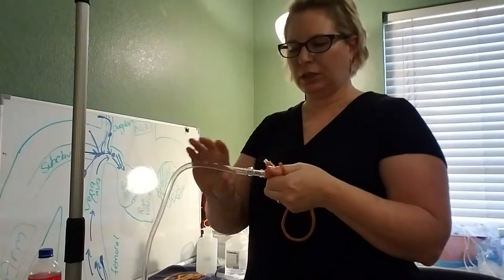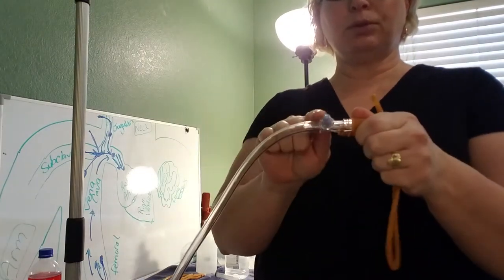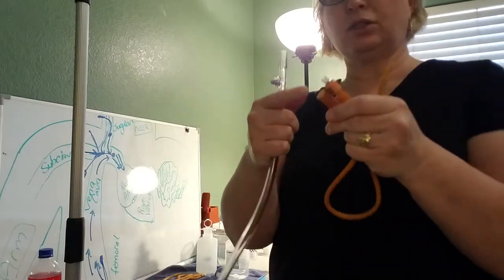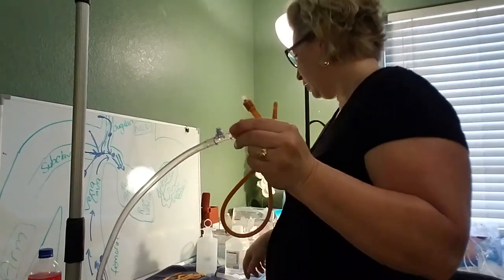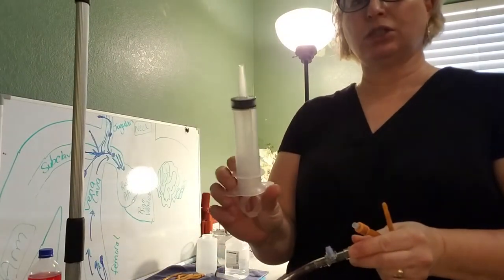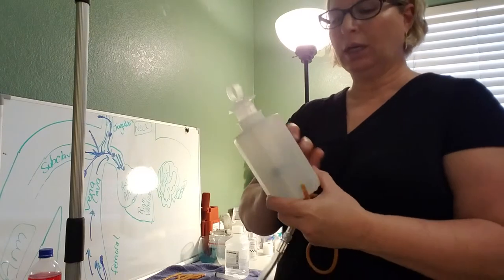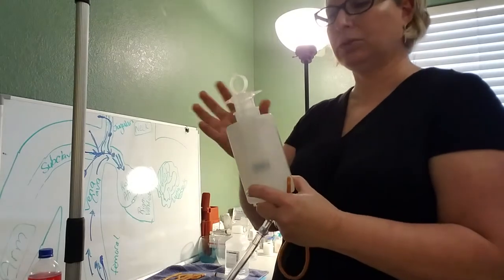If you ever needed to irrigate a Foley or do a collection sample, you can do it from this port. Best practice, though, is to disconnect the Foley and do your irrigation through this end. A 60mL syringe is generally your irrigation tool — it's the same as the NG tube care kit that you would use for giving NG meds, but you would use a separate one for a Foley. Do not reuse one that was used for NG tube meds.